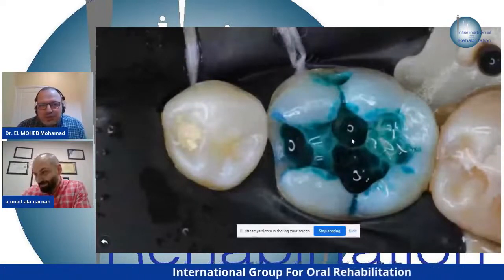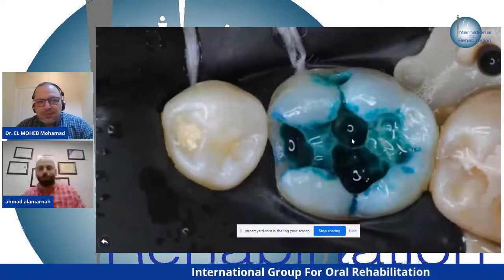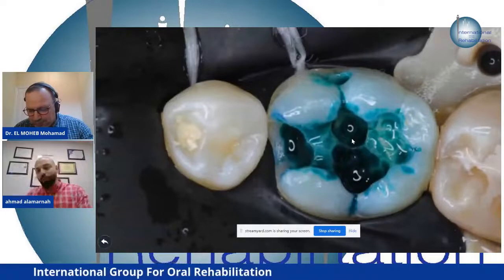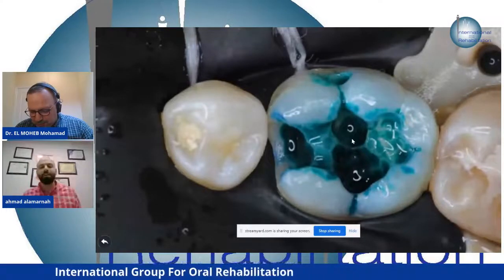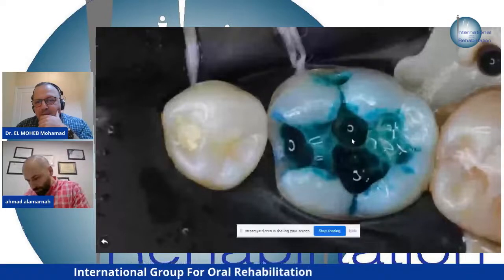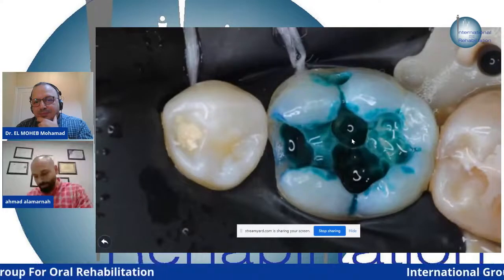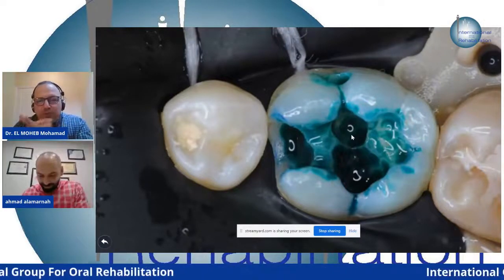I'd like to interact with the comments. How do you use the caries indicator? What are the steps? Apply it immediately after finishing cleaning the cavity — wash it and see if there's any stain. Let the audience answer while we continue.